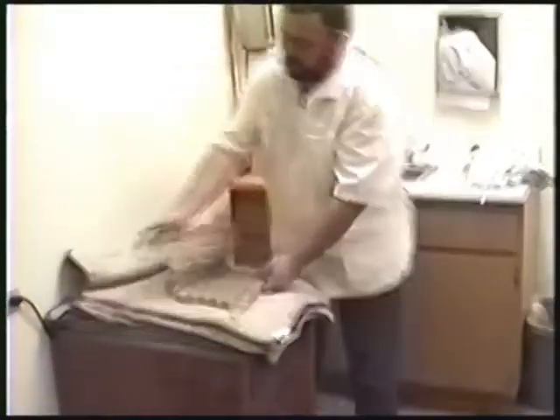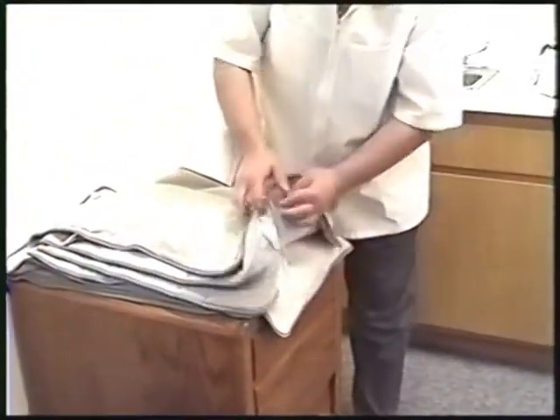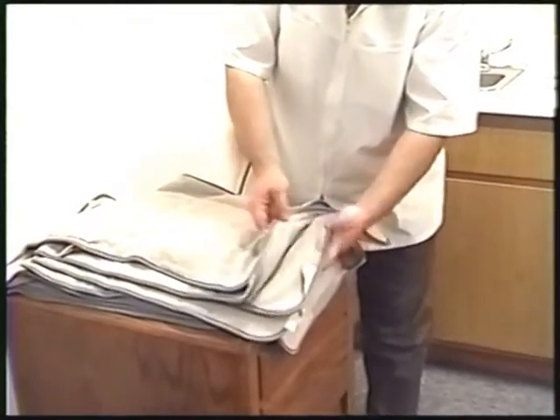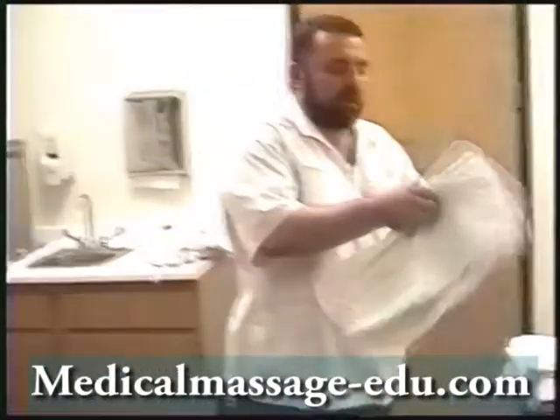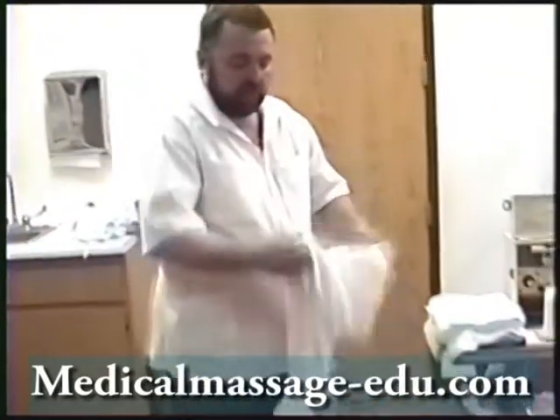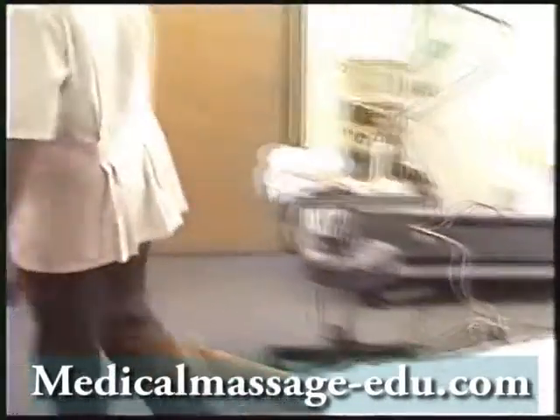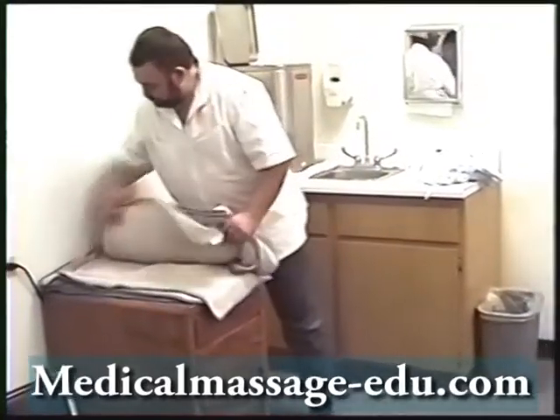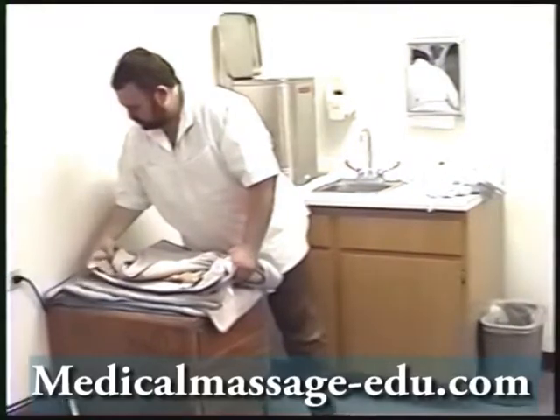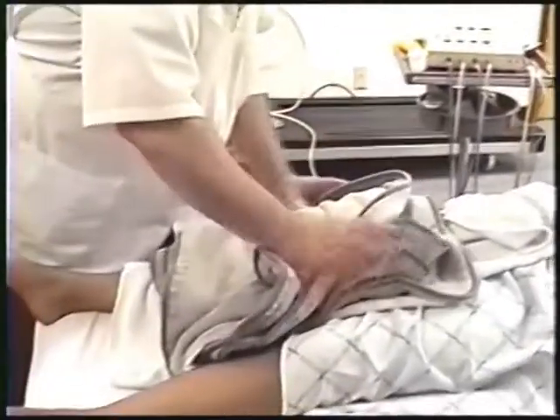This is a kind of insulator to protect against the burning effect. This is why we use it. You see — one on top, then two, three layers. Usually one, two, three layers are placed in order to protect, and of course the towel must be on the top of the area where we apply the hot pack. Again, one, two, three, and then like this, we put the hot pack on.